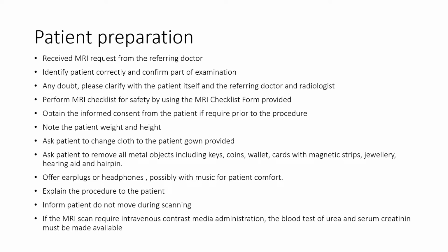Ask the patient to change into the patient gown provided. Ask the patient to remove all metal objects including keys, coins, wallet, cards with magnetic strips, jewelry, hearing aid and hairpin. Offer earplugs or headphones, possibly with music, for patient comfort. Explain the procedure to the patient. Inform the patient not to move during scanning. If the MRI scan requires intravenous contrast media administration, the blood test of urea and serum creatinine must be made available.